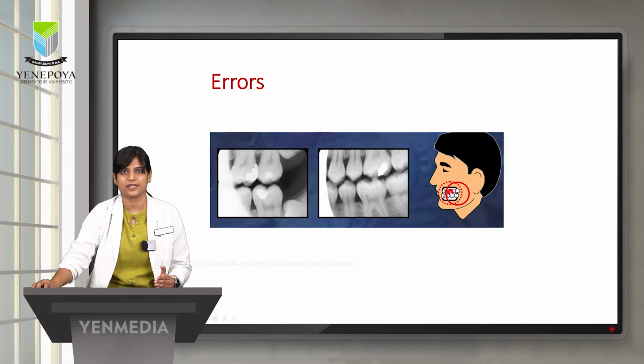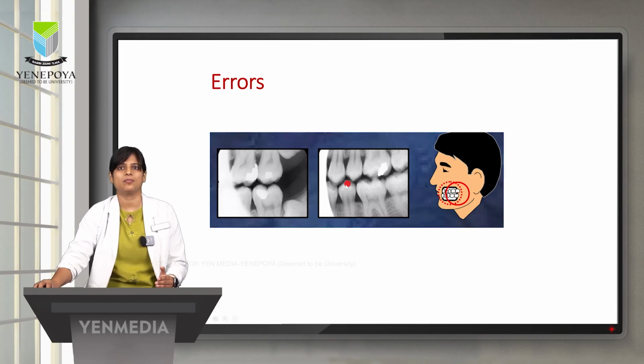Clearly, that is the center of this dotted circle. Whereas what has happened over here is it has gone beyond that. The central X-ray is here. So that is way beyond the outer canthus of the eye, thereby resulting in a cone cut.